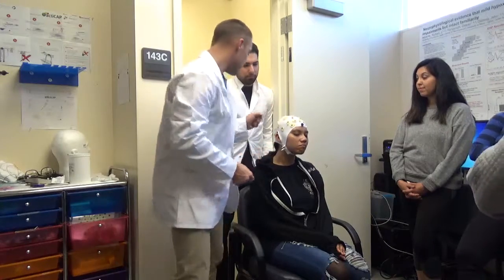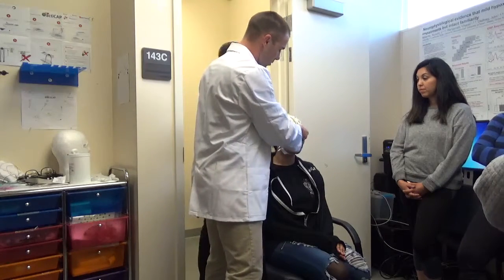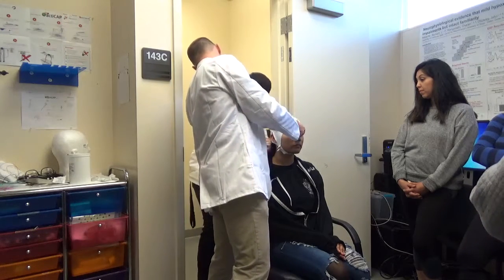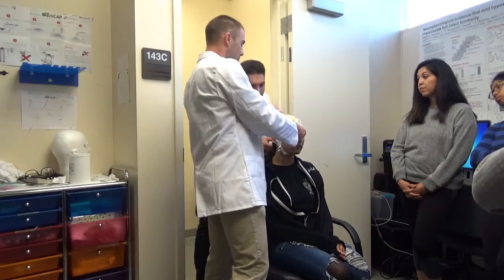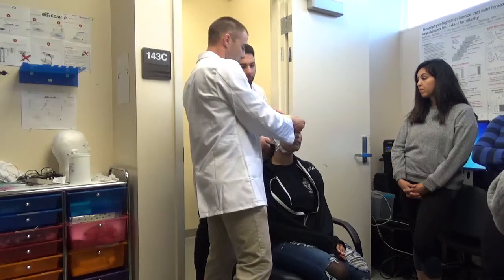Okay? Now you also want to verify. You pull that back, and you go from this spot between the eyes essentially down to the nape of the head. There you go. And you want this to be in the middle. So what's that number at right about there? 15. Okay, 15. That's perfect. So right about in the middle there.